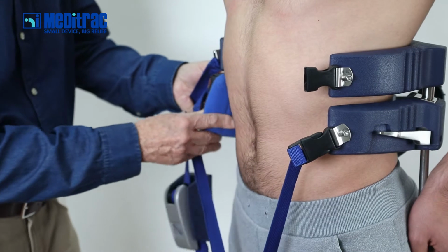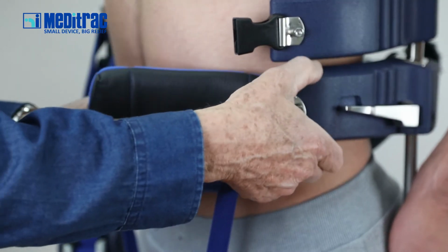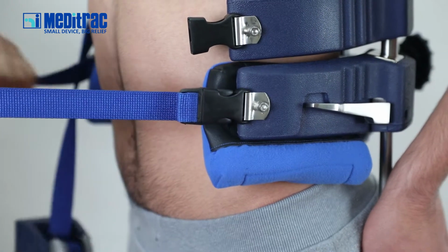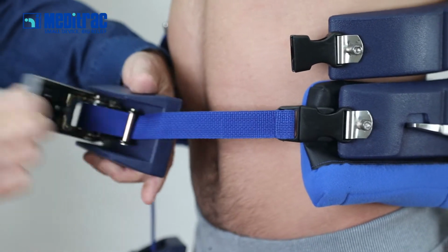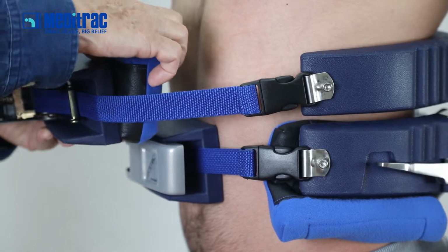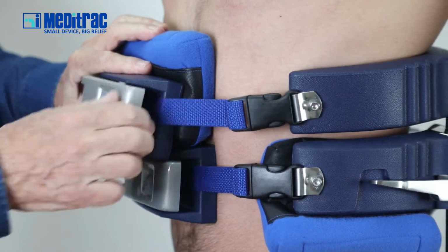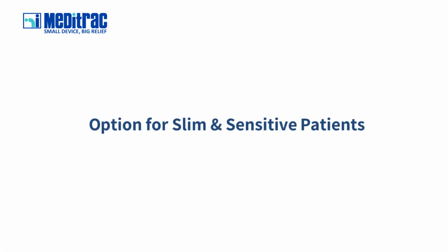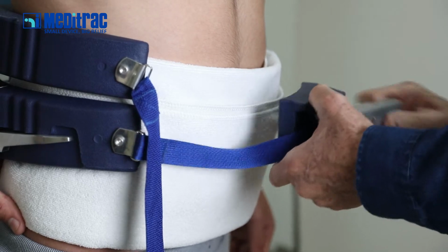Use the comfort pads if the patient feels excessive pressure beneath the sternum or on ribs or iliac crests. For small-bodied patients, it may be necessary to use the comfort pads in order to allow the upper and lower frames to be tightened sufficiently. In very small or sensitive body patients, we recommend using a soft towel around the waist.